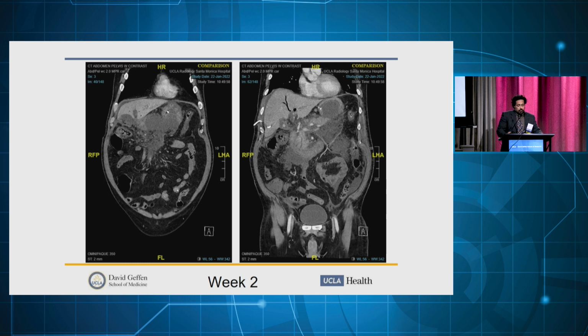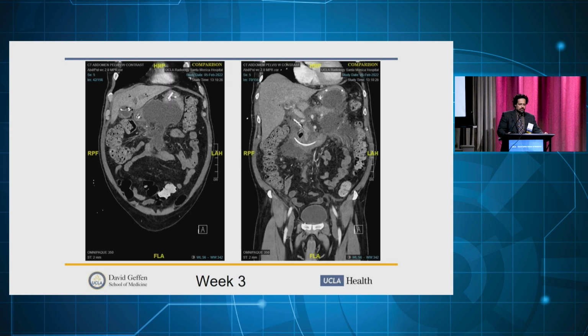Here's a patient that we've been taking care of just to give you a real-time evolution. Came in with a biliary pancreatitis and a clearly extensive acute necrotic collection involving multiple zones of the pancreas into the retroperitoneum, into the pericolic gutters. But you can see here that all that fuzz in the middle is poorly defined, and the pancreas itself is kind of doing okay, but there's a lot of peripancreatic necrosis. This is not a time to drain this person. You would regret it most likely if you put an endoscopic drain in the absence of a mature wall.